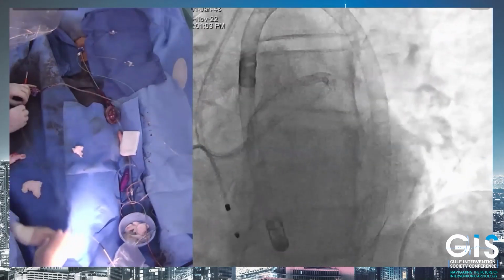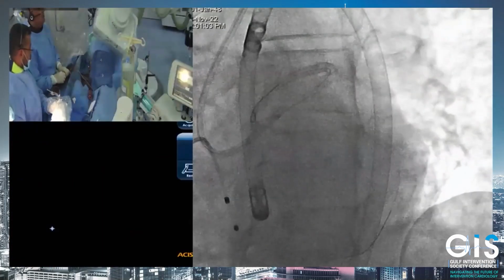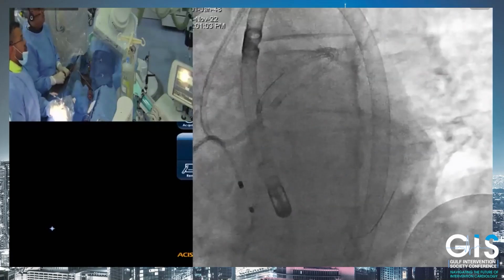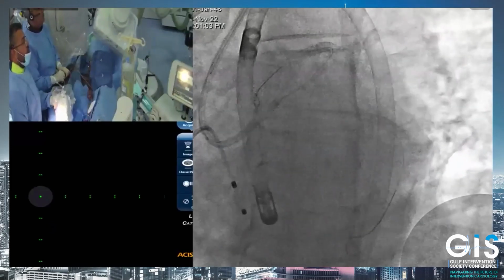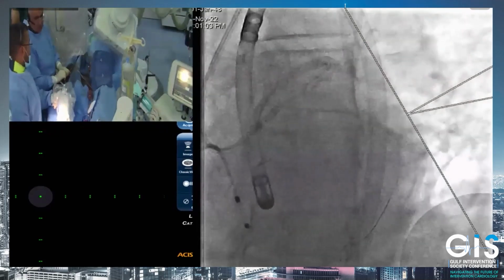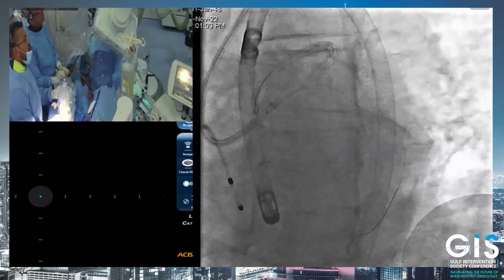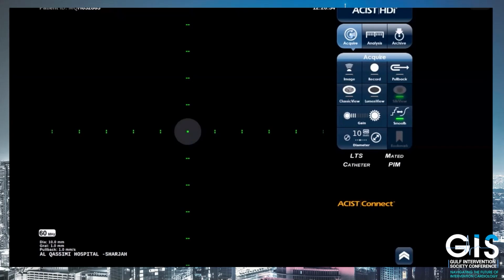We'll see. I think looking at the anatomy in this patient, you do have a heavily calcified lesion extending all the way from the left main to the LAD. You have a creatinine of 140, so I would lean towards IVUS. It's going to assess the left main better than OCT, and it's also going to avoid contrast. I think I would agree with just dilating the ostium LAD with a small balloon.